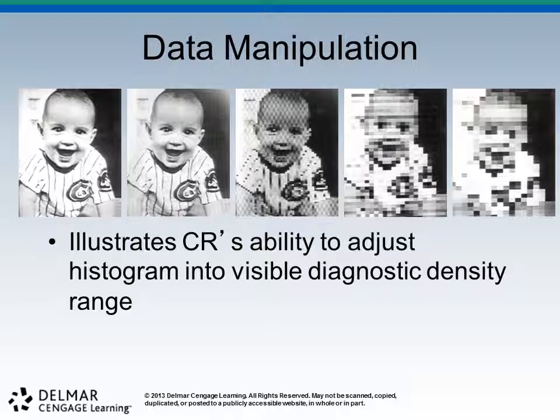Low value data, small file size, doesn't cost a lot. We can tell this is a kid. Well, he's not a kid now, he's like 30 something. But we can see that. But the farther over to the left we get, the more expensive we get because now we've got much more detail, many more things to see, much more shades of gray, a much deeper, higher spatial resolution image.